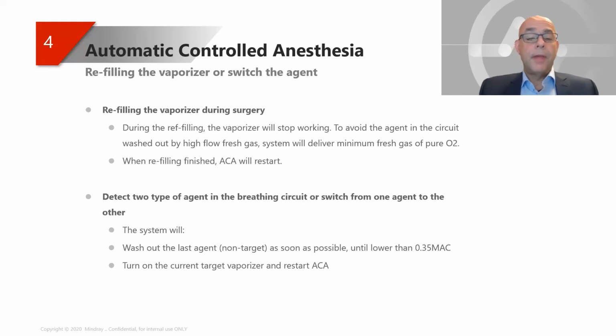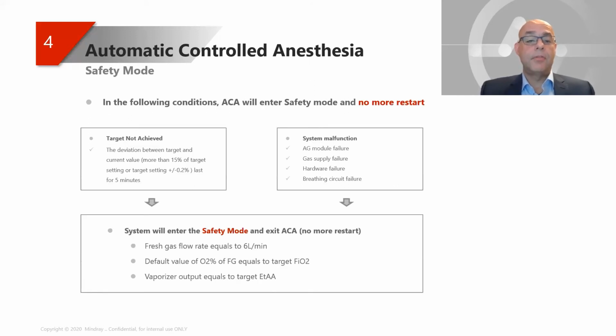Also, during refilling of the vaporizer during surgery, if you open up the lid, it will stop working, and then you can fill. And as soon as the filling is done and you close the lid again, it will automatically restart the ACA. Also, if two different kinds of anesthetic agents are detected in the system, the last non-targeted anesthetic agent will be washed out very rapidly until it's lower than 0.35 MAC. And then it automatically turns on the chosen new anesthetic agent and vaporizer and will restart the ACA function.